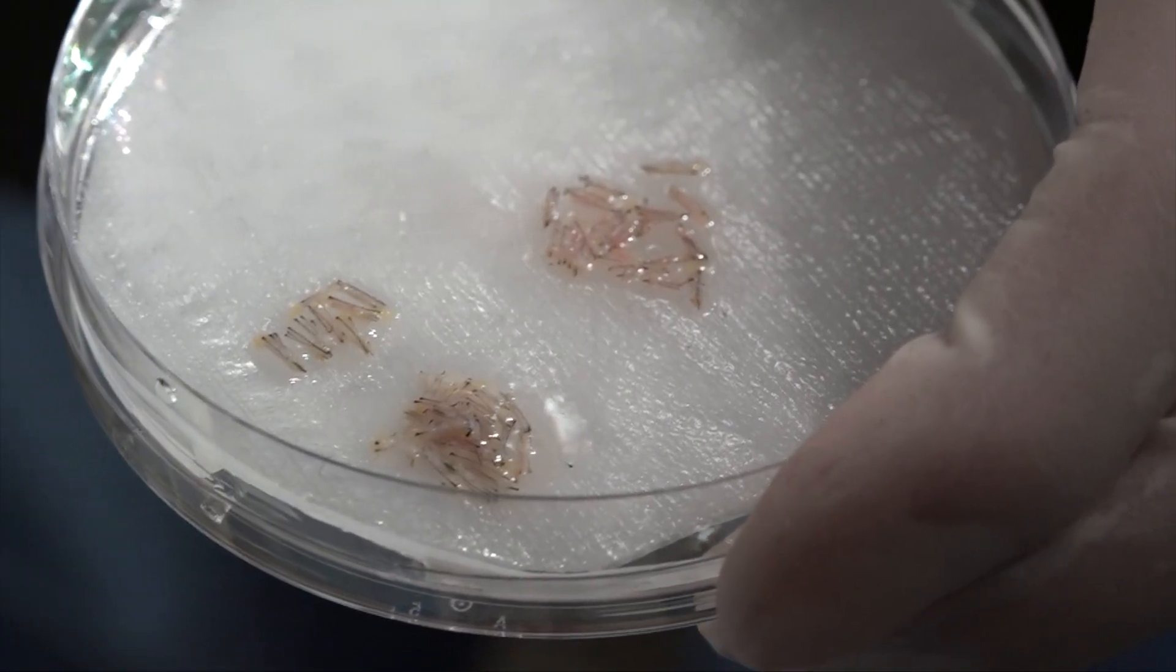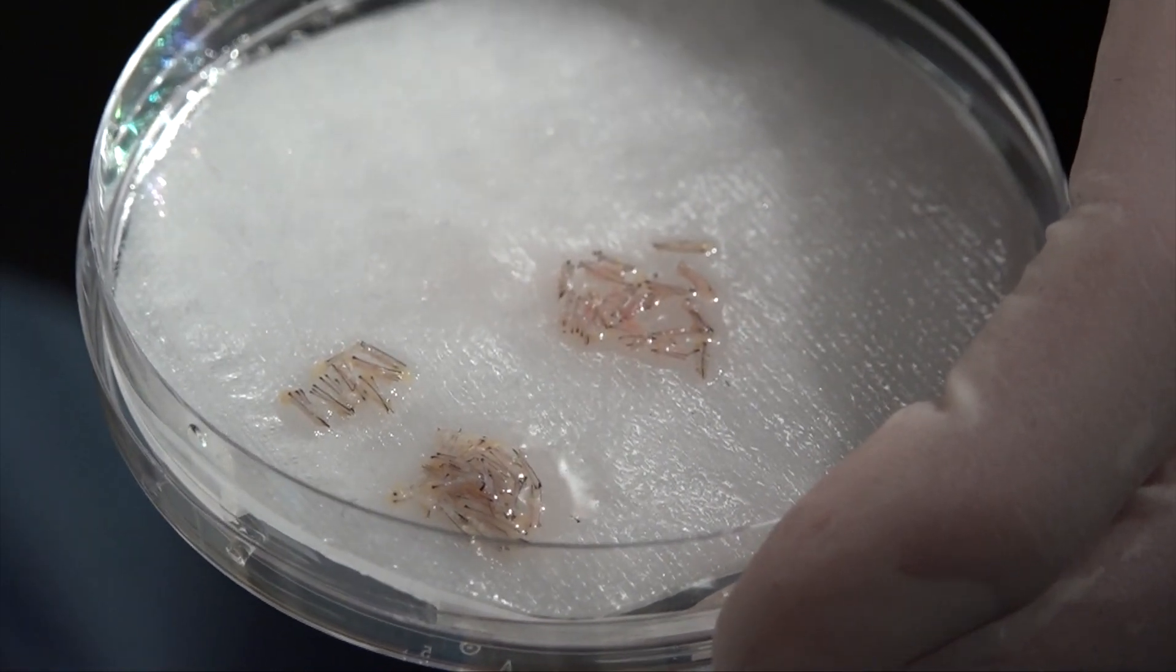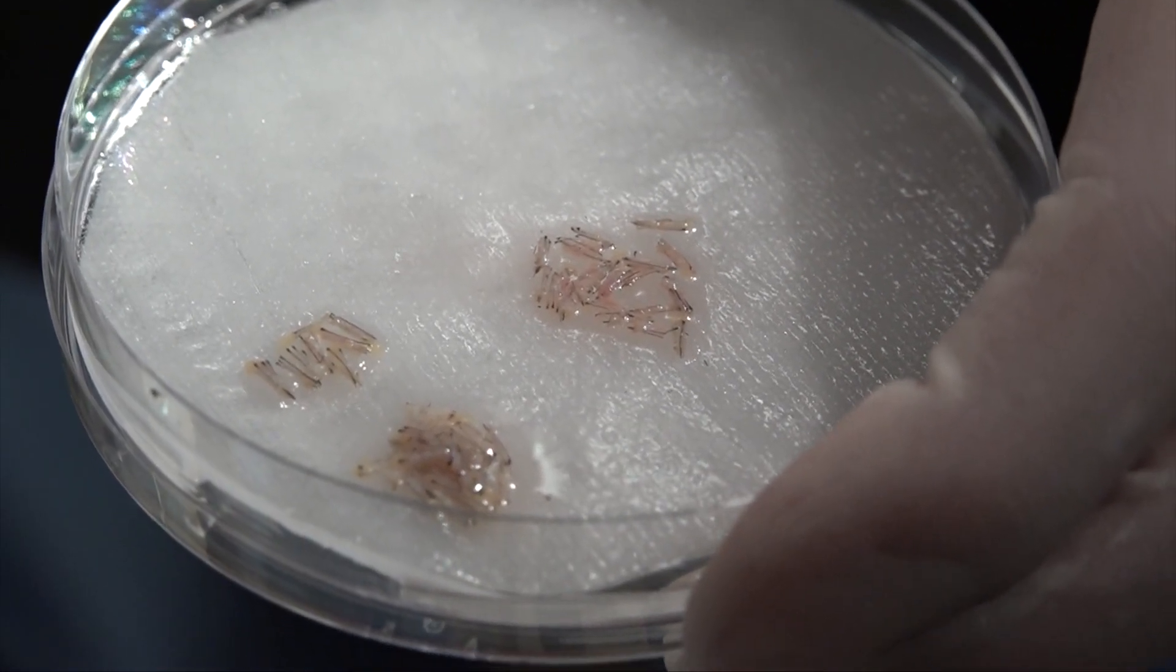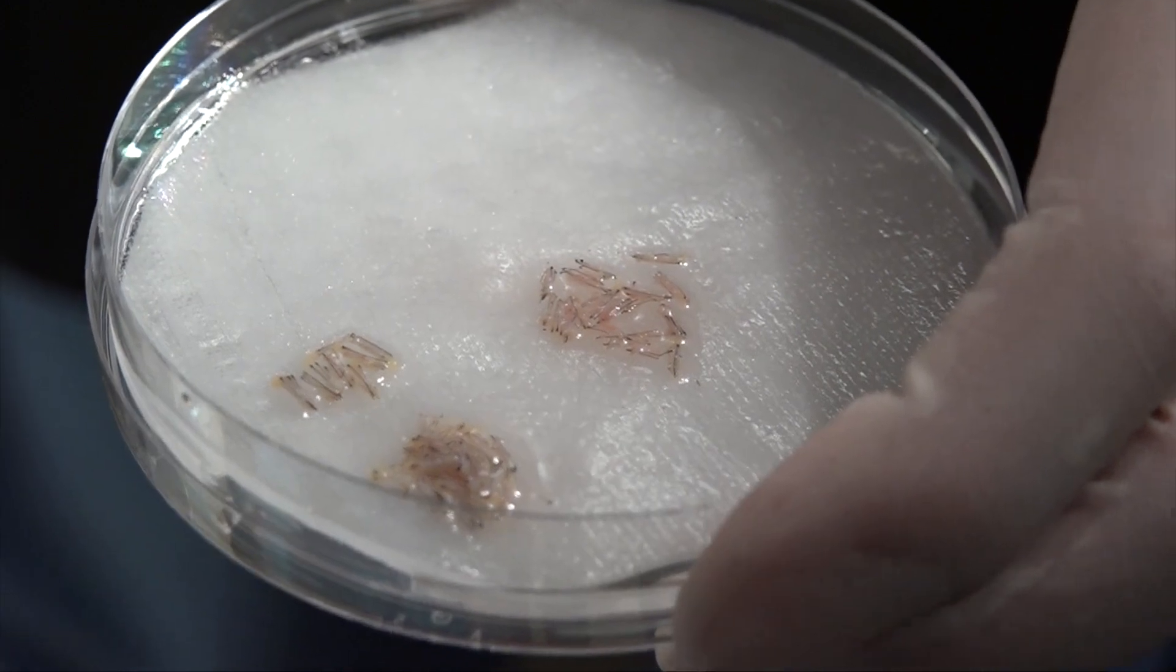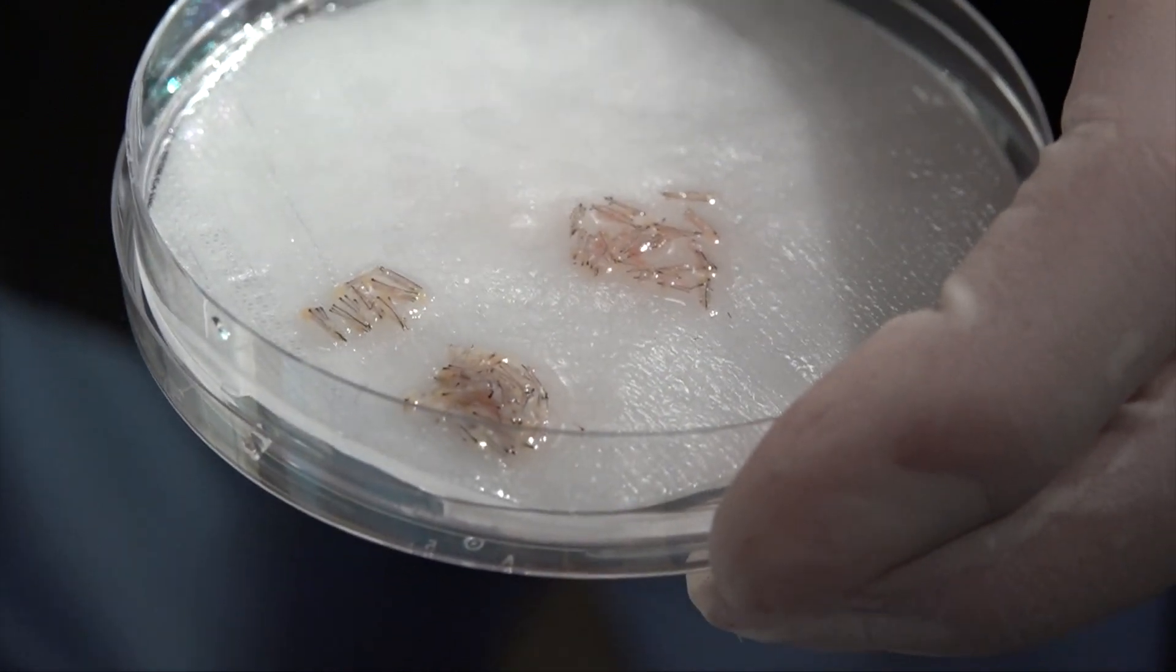These grafts are absolutely perfect. We have some grafts that have up to six hairs in them, which is fantastic, so it's going to give us really nice density. You can see the accuracy with which these grafts have been extracted, absolutely perfect.